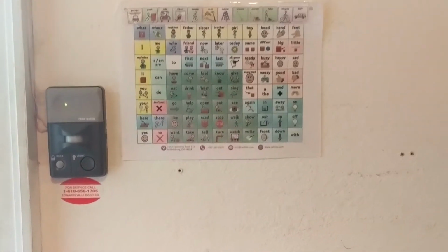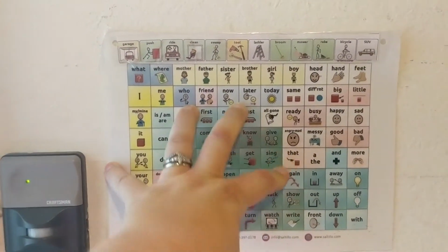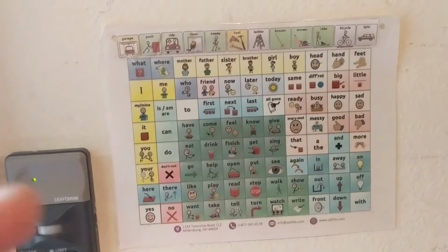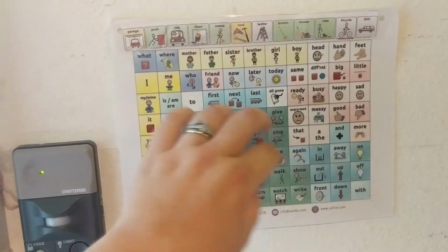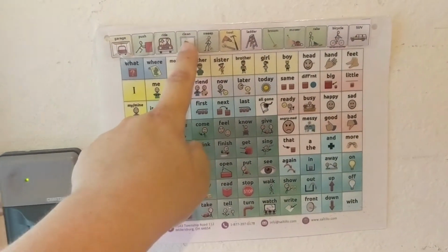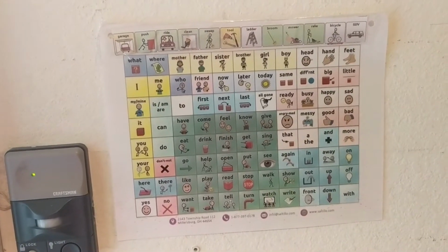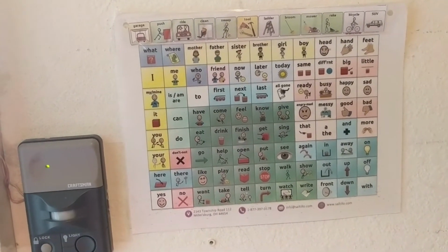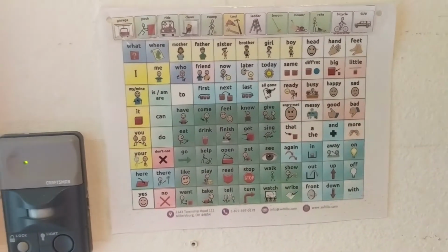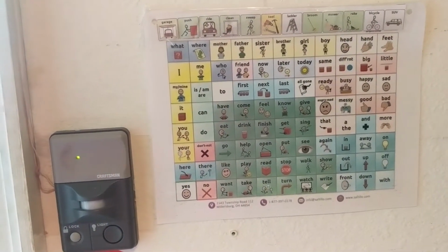And up here at the top, I have my fringe vocabulary. So my core is super powerful. I can communicate all types of communication functions with it. However, we also know that fringe vocabulary is powerful for our children to be able to communicate as well. I also like to put additional core words that go with the room that I'm posting this in up there at the top too. And I have a link down below for how to get the chat editor software free to download onto your computer so that you can snip out these symbols and be able to post them up there like I did as well.